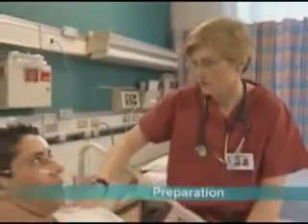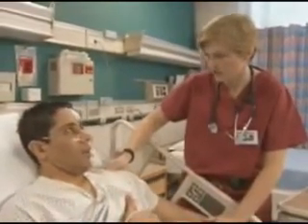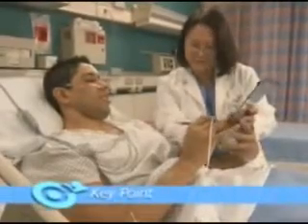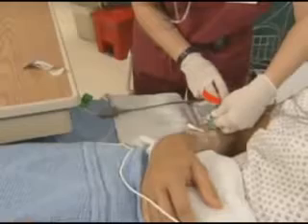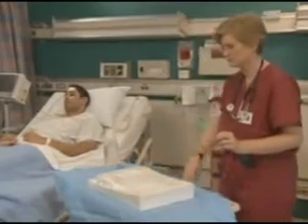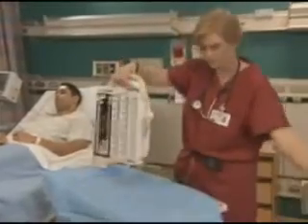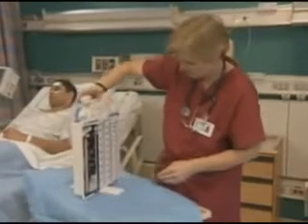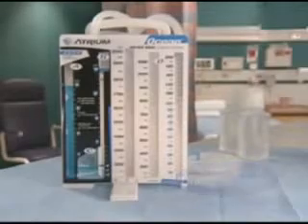When your patient needs a chest tube, prepare him by explaining the procedure and providing reassurance, making sure that the physician has obtained informed consent, and administering an analgesic or a sedative as prescribed. Also, prepare the equipment, including the closed chest drainage system. To understand how this type of system works, consider its components. A disposable drainage system usually has 3 chambers, each with a different function.